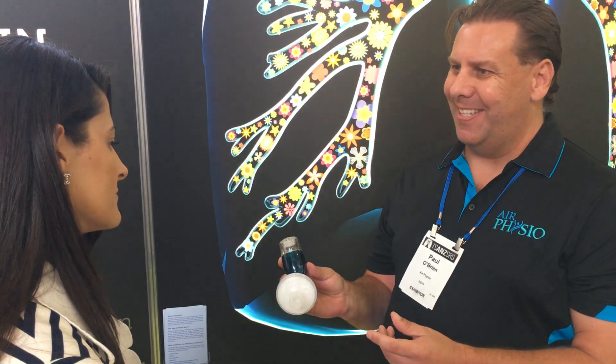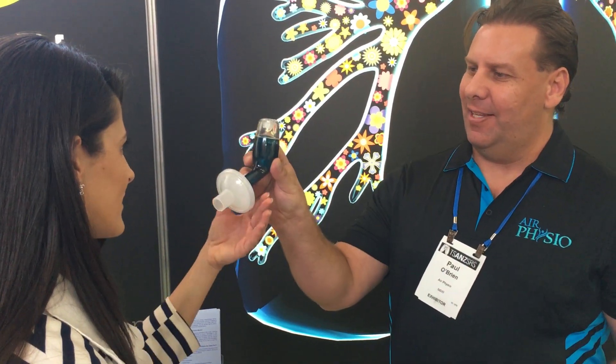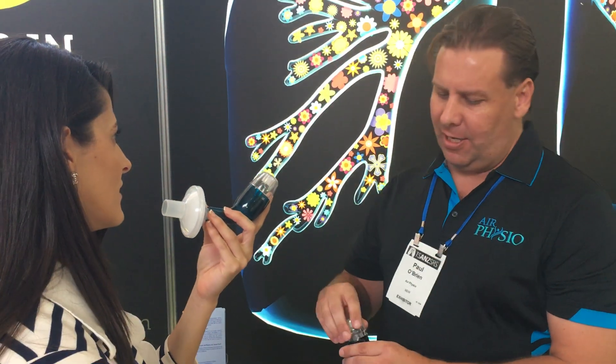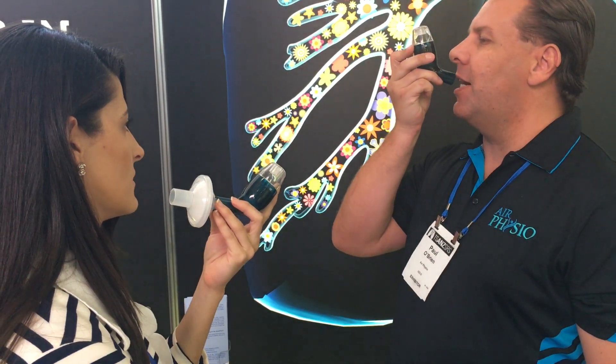Do you want to blow into the device? So all you do is tilt it slightly. Take a good breath in — about 2 to 3 seconds — hold the breath in, then blow into the device so it gives you the sensation.